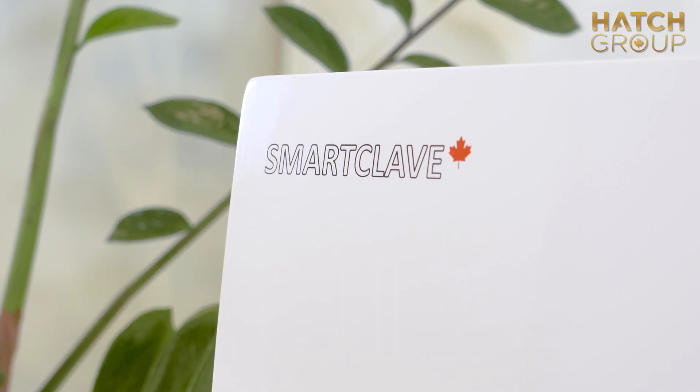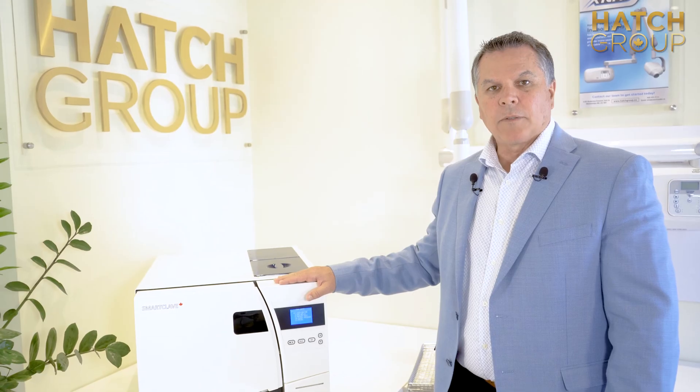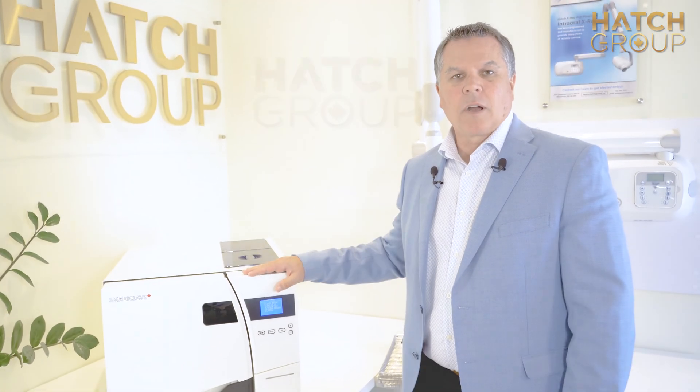One of the great features of the SmartClave is it's 110 volt. You do not have to get an electrician in for 220 or a buck and boost — it's just plug-and-play and you're ready to go.